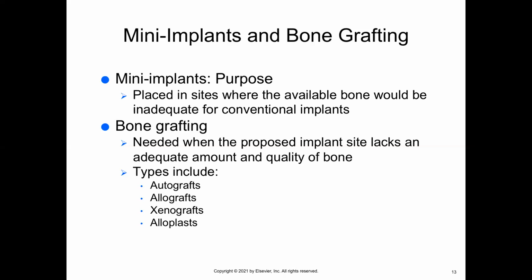This is usually done by an oral surgeon or periodontist. What they do is expose and cut the bone to create a window to the floor of the maxillary sinus. Once they achieve that, an instrument is used to separate the sinus membrane from the bone and lift it up. Grafting material is placed into that space, and the soft tissue flap is repositioned and sutured. Healing time is usually about 4 to 6 months, and that's before they can actually place the implant.